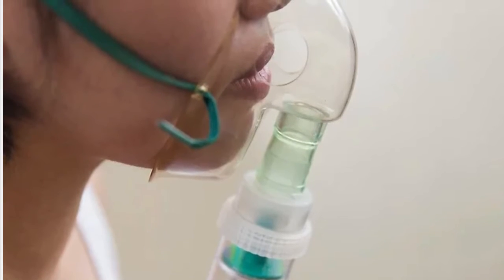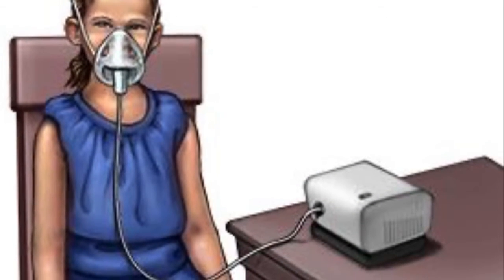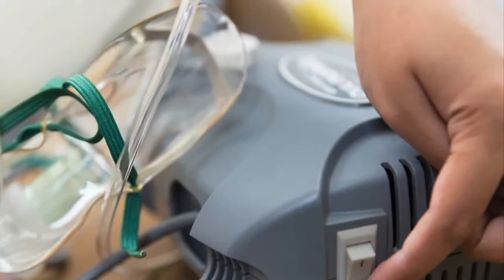Second is to continue to inhale the medication. Sit up and keep inhaling the medication until the mist stops. This usually takes about 10 to 15 minutes.